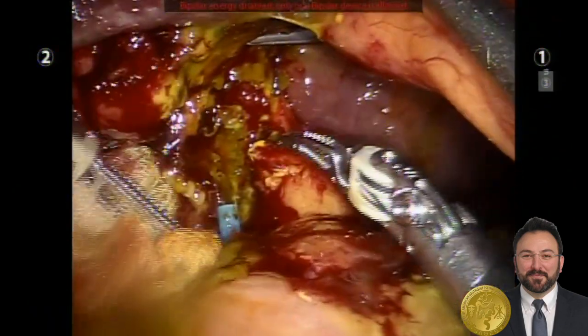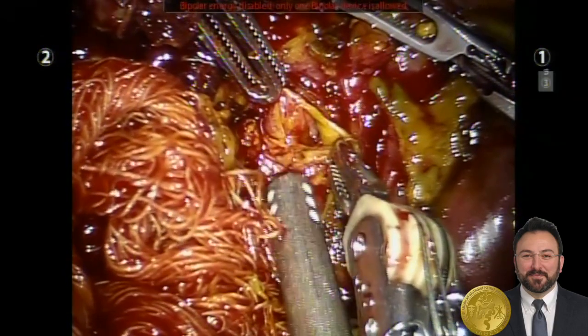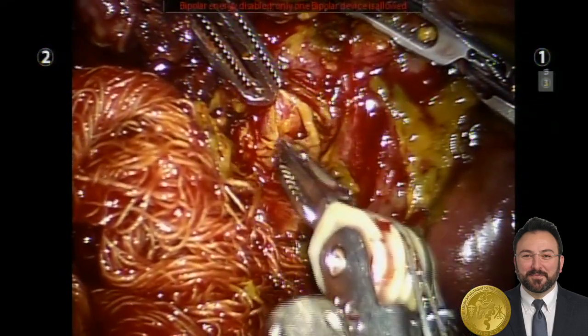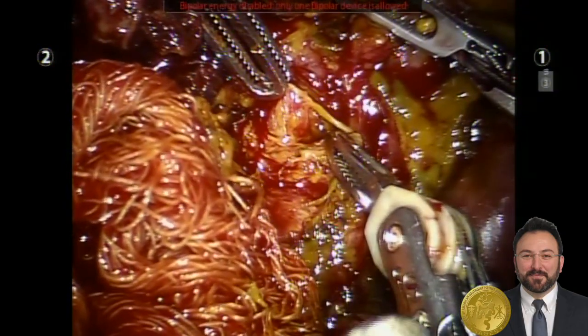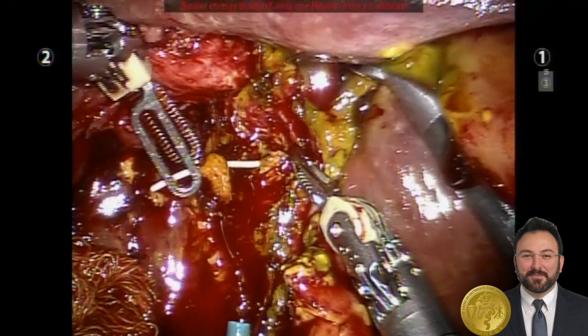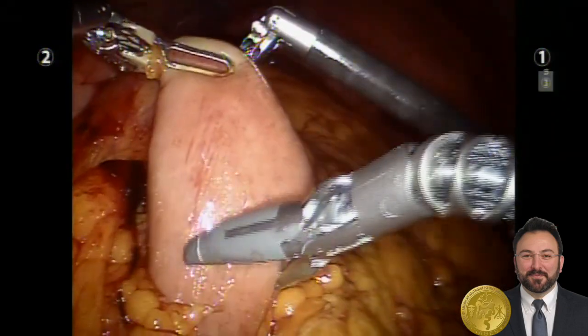A large biloma was encountered upon entry into the abdomen, and after cleaning up blood and bile, we began to identify the actual bile duct injuries. Here we have one of the bile ducts from the right system. The left system was able to be cannulated using the PTHC catheter placed by interventional radiology, which assisted in identification.